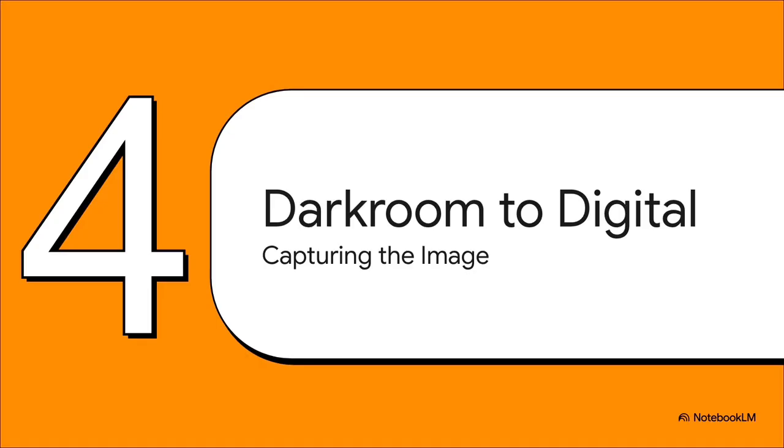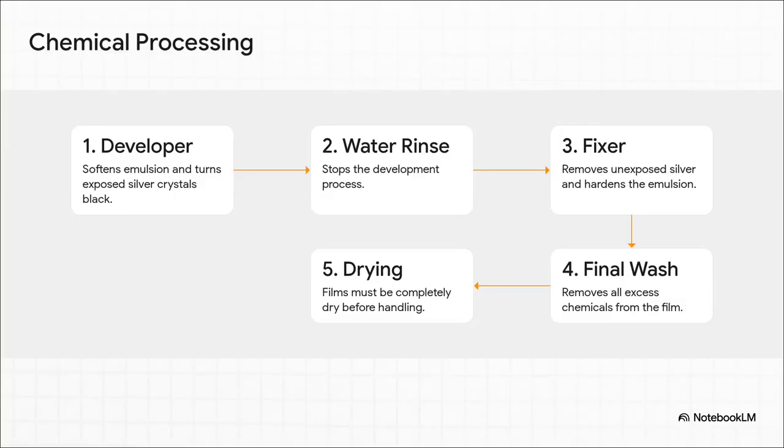Okay, so we've made the X-rays, but now you have to capture the image, right? And back in the day, that was a whole other messy challenge. We're talking dark rooms, smelly chemicals, and just so many ways for things to go wrong. Yeah, before digital came along, developing an X-ray was this whole complicated dance.